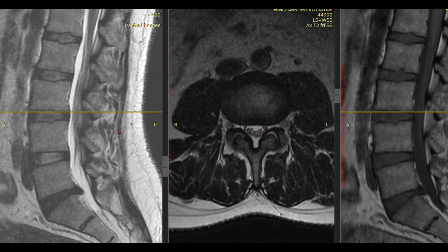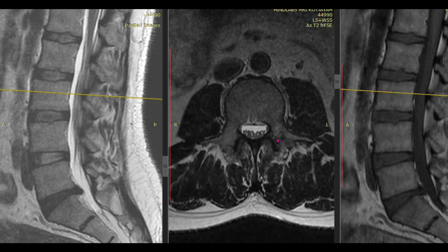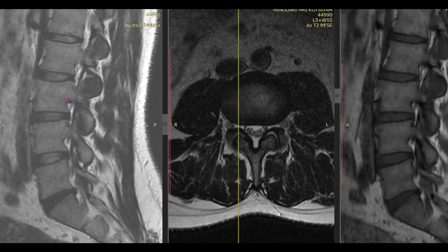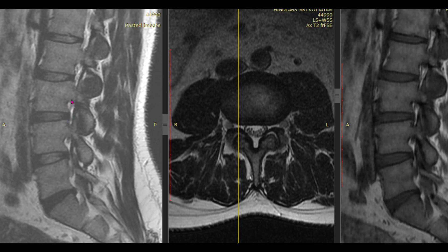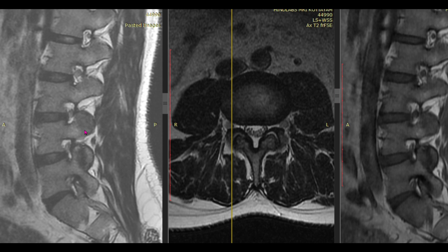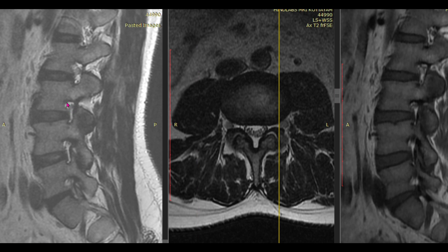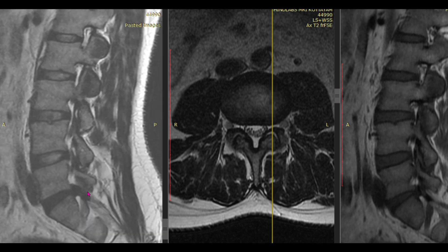To assess the neural foramen, that is this area here, and the exiting nerve root — whether it is getting compressed — you look in the sagittal section to see whether the keyhole morphology is maintained. Here the keyhole morphology is somewhat maintained but there is some narrowing in the inferior quadrant, while the nerve root is in the superior quadrant. If significant, I would grade this as a grade-one narrowing, since the nerve root is surrounded on all three sides by fluid. On the opposite left side, you see a wider and more normal-looking keyhole.